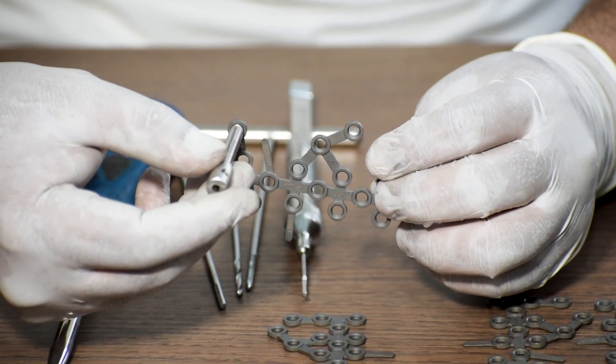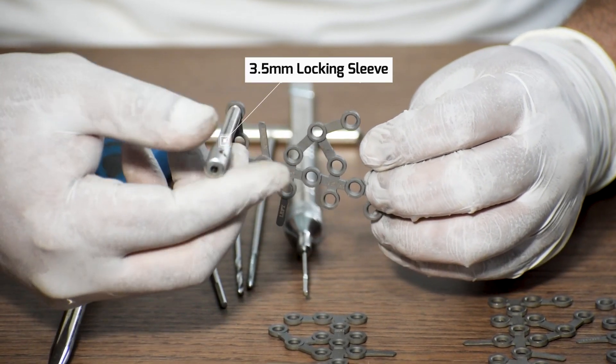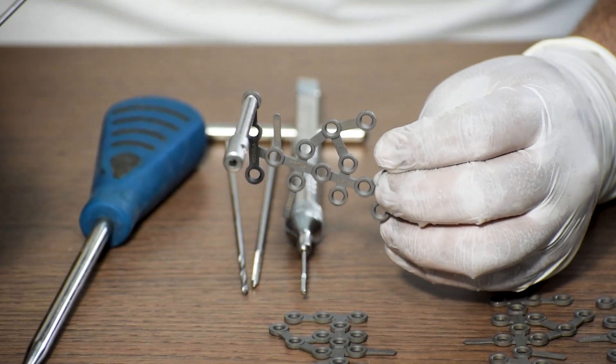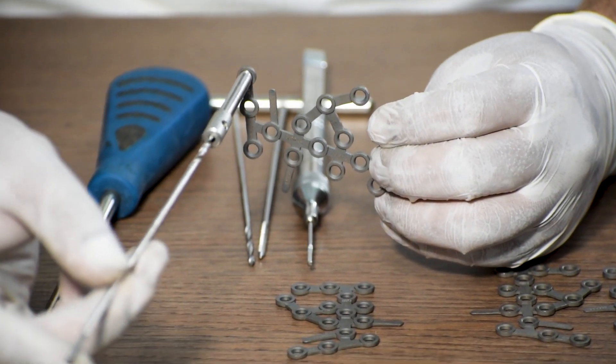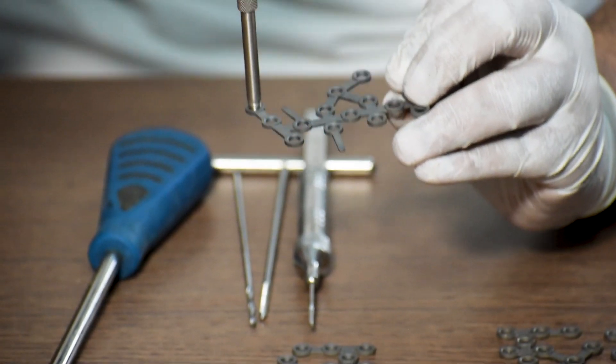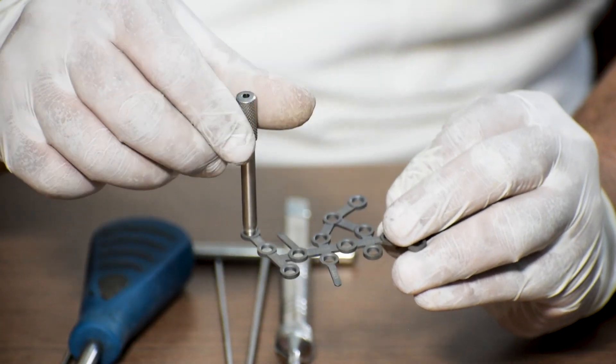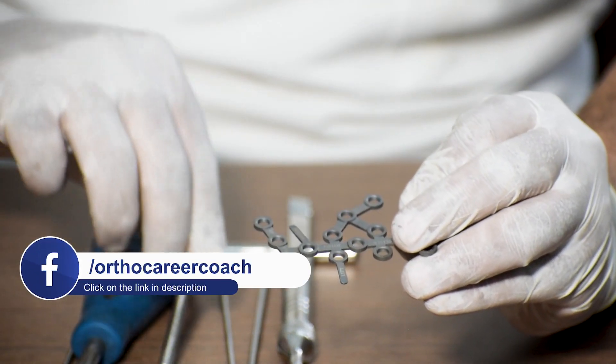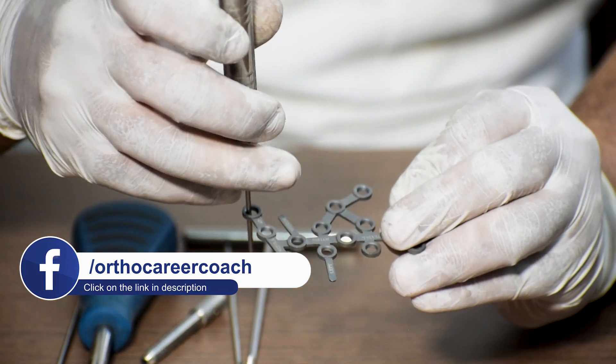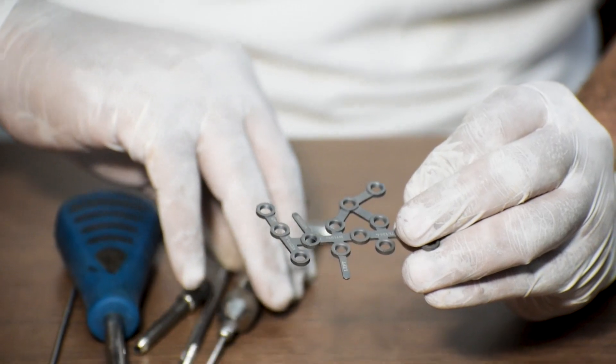In order to fix a 3.5 mm locking screw, first we will attach the 3.5 mm locking sleeve in the plate. Then we take a 2.8 mm drill bit and drill through the locking sleeve. After the drilling is done, we remove the locking sleeve and use the depth gauge to measure the length of the screw that is needed to be provided and fixed in this plate.